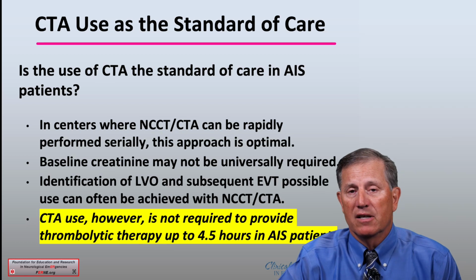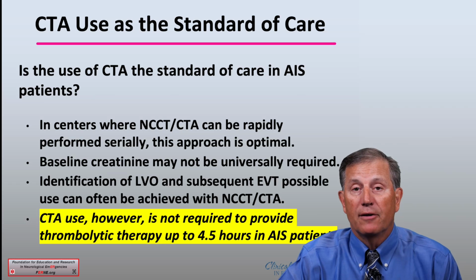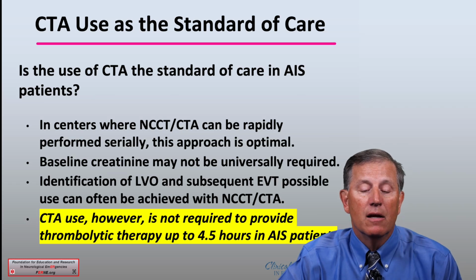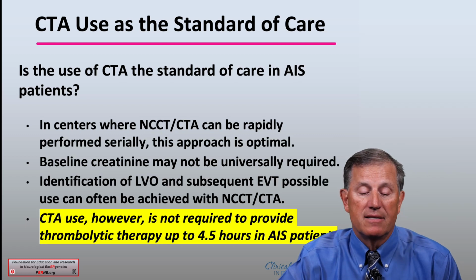In fact, without significant renal risk, it probably should not be determined before the CT and the CTA can be done. With the non-contrast CT and CTA, the ability to identify an LVO and to transfer patients for EVT is often easily achieved because of the ability of these two tests done serially.